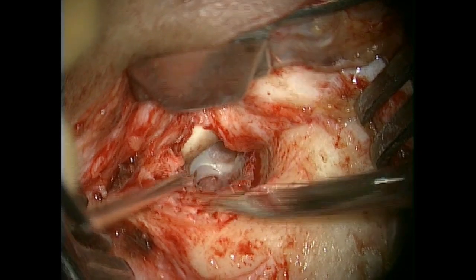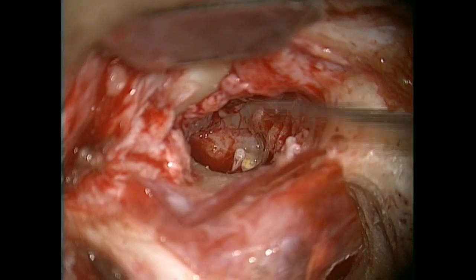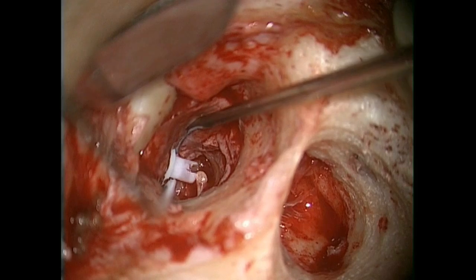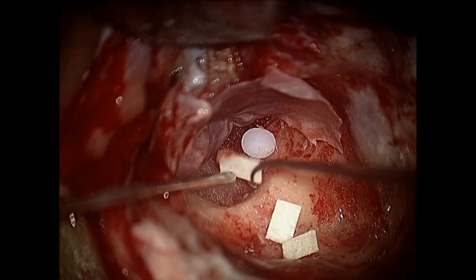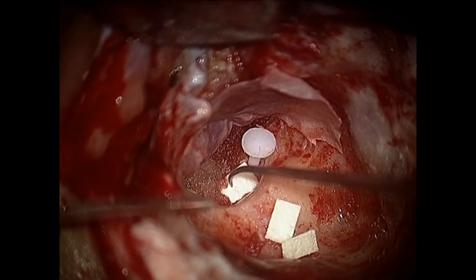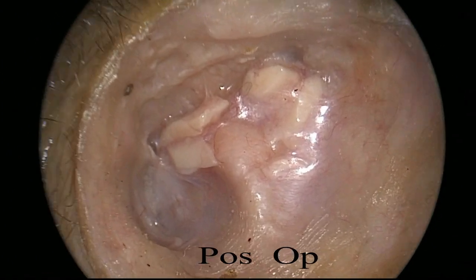In my practice, I have tried a lot of alloplastic materials in the beginning. As you see in this case, it is an intact canal wall tympanoplasty where I am using Teflon PORP as a short columella. I am making the PORP sit on the mobile stapes. This is a modified radical mastoidectomy where TORP is being used from footplate to neotympanum, and this is the well-healed drum with a vibrating tympanic membrane and ossicle you can see.